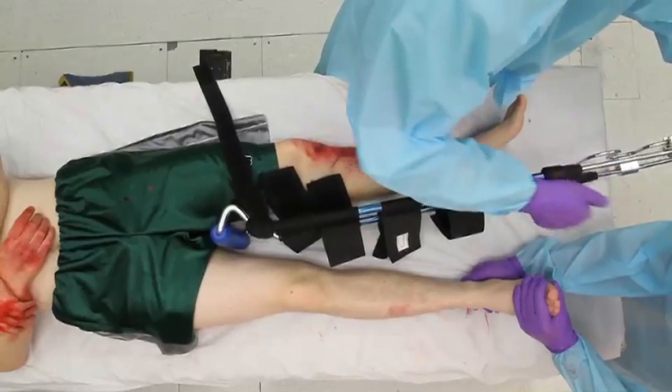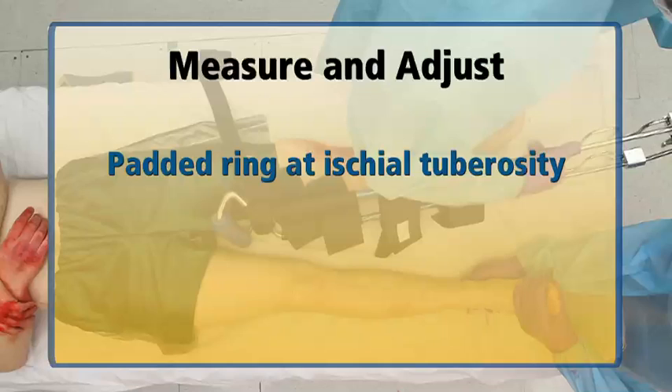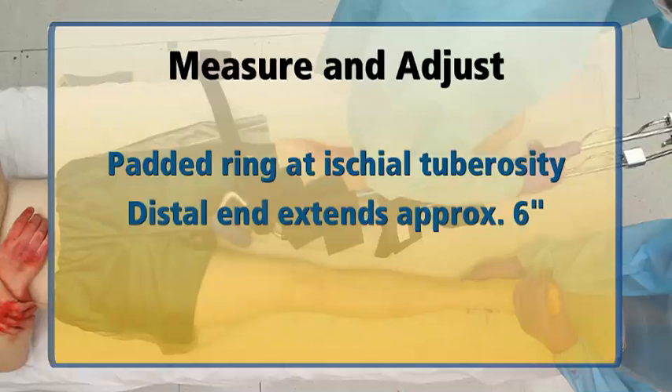You can determine the length of the splint by measuring the patient's uninjured leg. The upper cushioned ring should be placed under the buttocks adjacent to the ischial tuberosity. The distal end of the splint should extend beyond the ankle by approximately 6 inches or 15 centimeters.